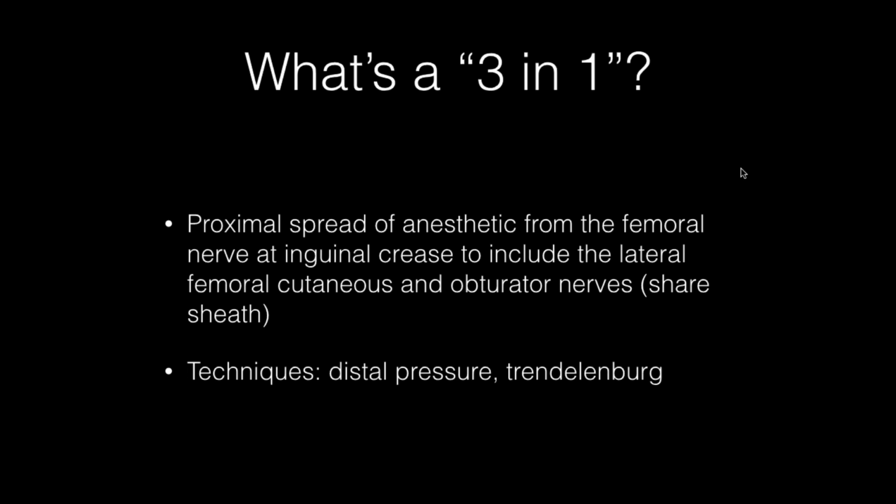All right, so that is how you do a femoral nerve block, and I've been referring to it as a femoral nerve block and not a 3-in-1 block, but that is out there in the literature, and so I wanted to address what that means, and is that different than what I'm telling you to do? And the answer is not really.